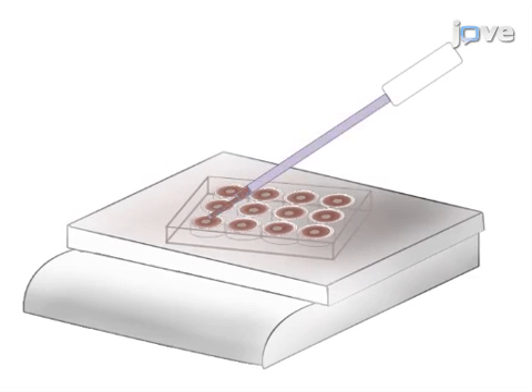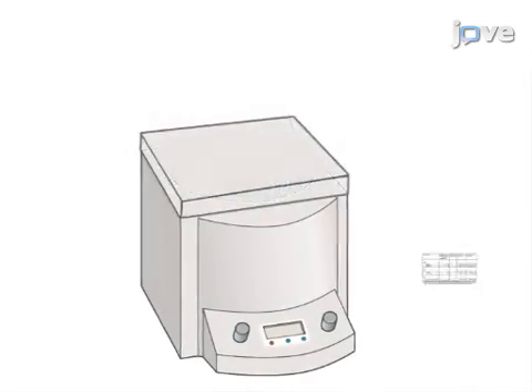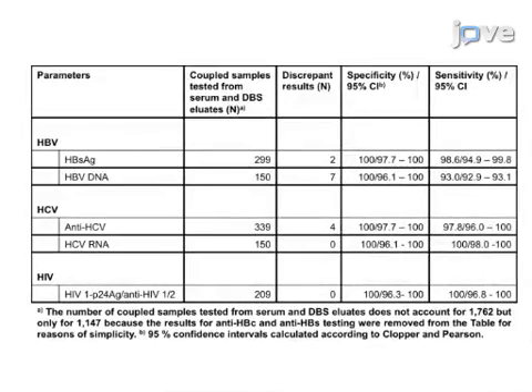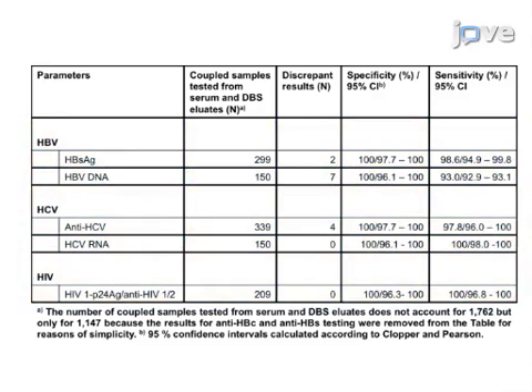The hemolytic eluates are then freed from debris by centrifugation. The final step is to analyze the cleared eluates for serological and molecular markers of infections with the hepatitis B, hepatitis C, and human immunodeficiency viruses by commercially available immunoassays and molecular techniques.